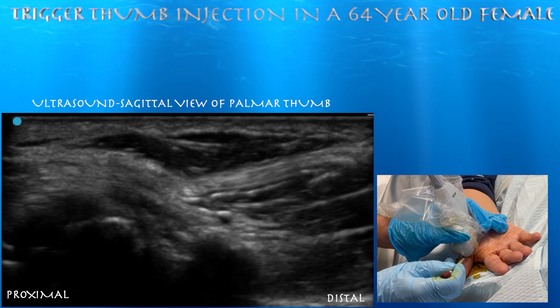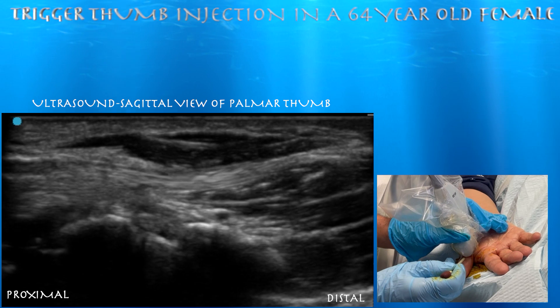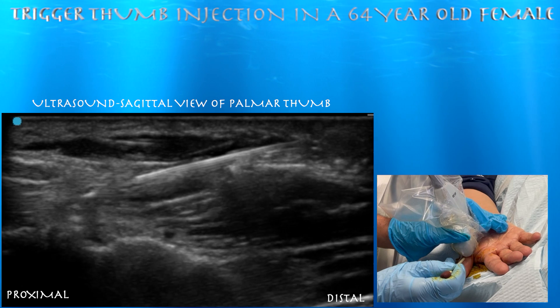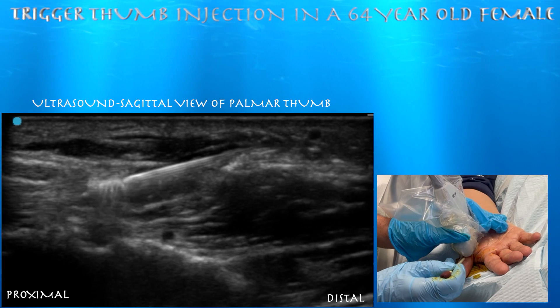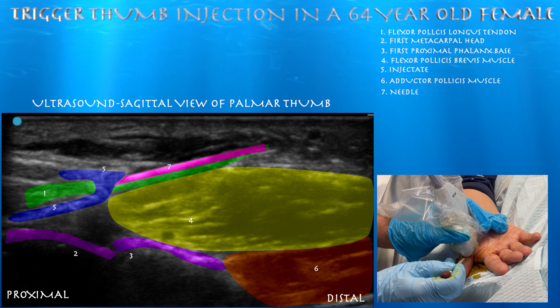Here we're getting ready for our injection. We are basically in a plane approach, and we're looking at the tendon in a long axis view. You can see the needle going right on top of the tendon, and now we're injecting. You can appreciate the injectate surrounding circumferentially around the flexor pollicis longus tendon.